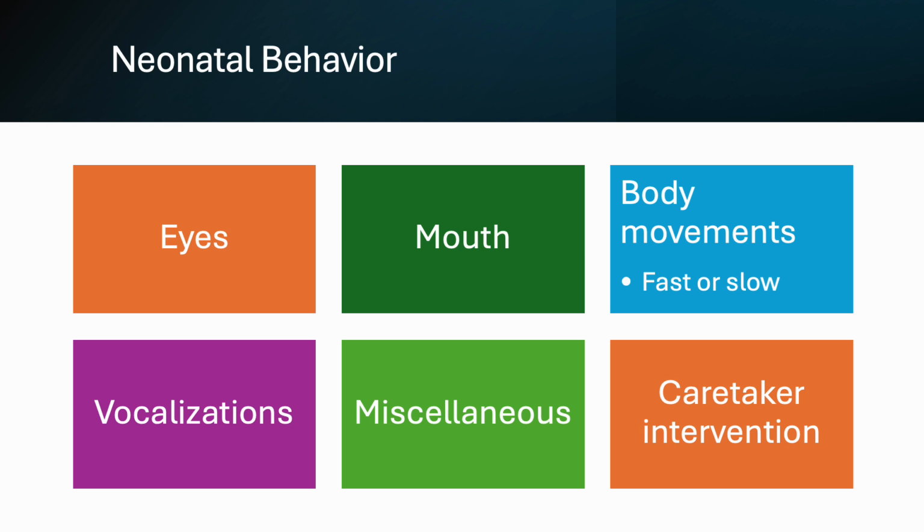Things to document on the record as they happen are if the eyes are open or closed, or if they're blinking. The mouth could be chomping, sucking, doing something rhythmic, or the infant could be pursing their lips. Also, for most of these things, you can confirm the artifact on the study that it makes. Pay attention when people or babies do things, and you can tell, like, oh, they're blinking or they're reading, and see what it looks like on the study. That'll give you a real good idea of what that stuff looks like.